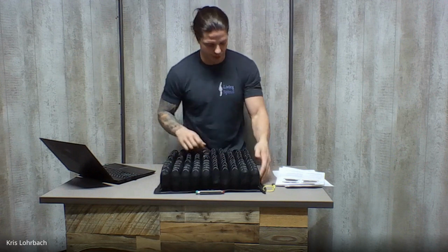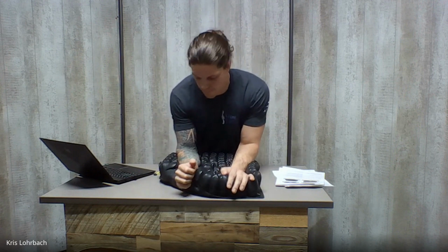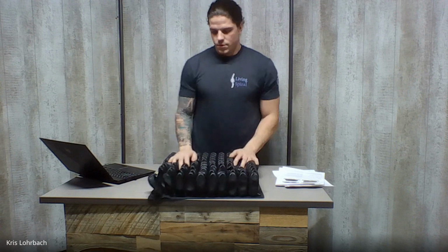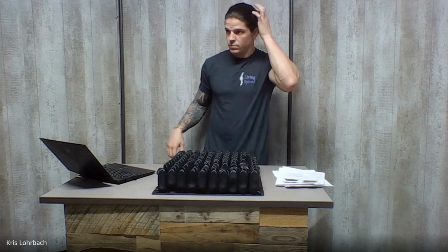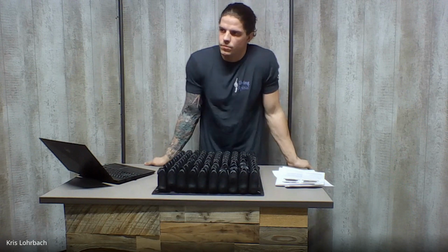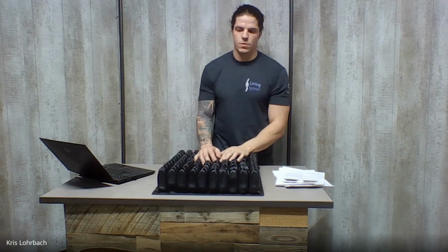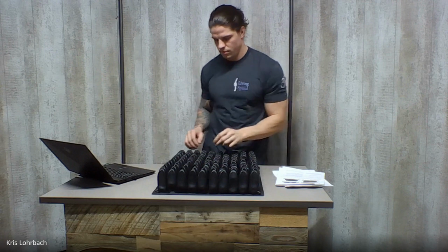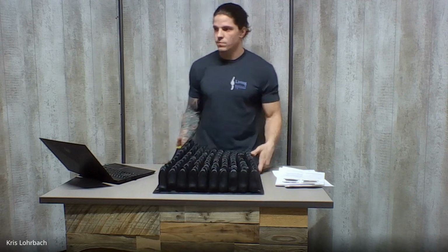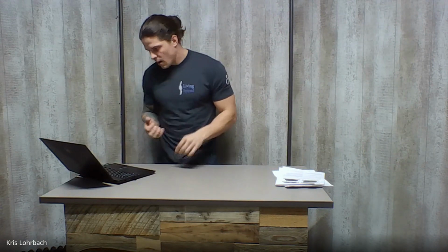Well, this is really inflated right now. Yeah, it's like this. And then they've got to try, and it's hard, especially if you want to be totally independent. You get up every morning, you've got to get in and out of this thing every night. So that is more of a concern with high profile cushions too. It's not a big deal, but it's just another thing to know and have in your repertoire, asking how's your transfer. So we went through foam, we talked about air.